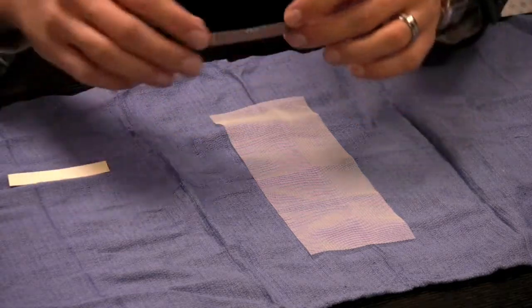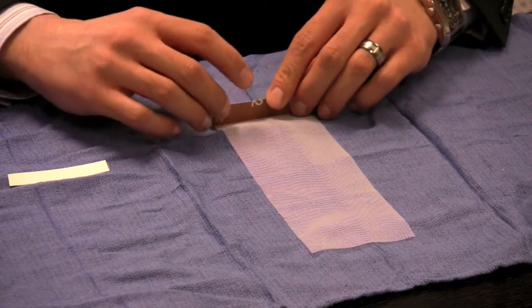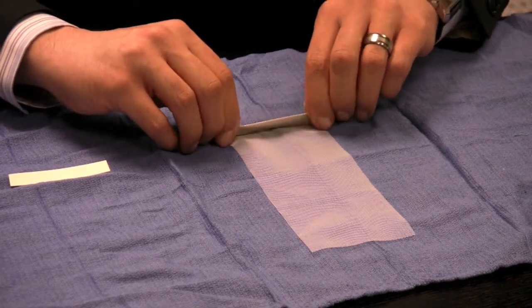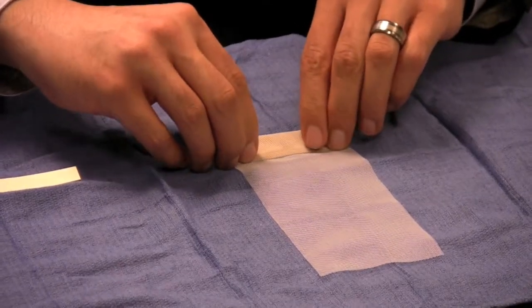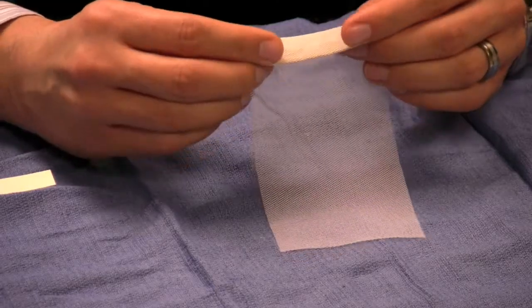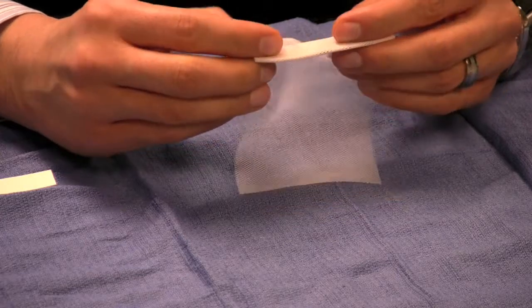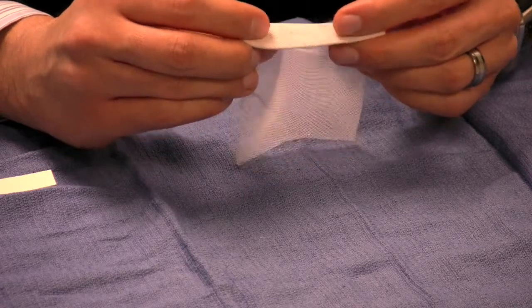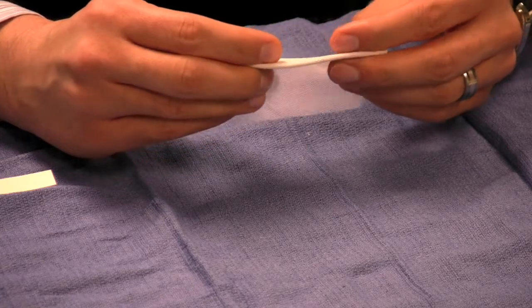Essentially it's got a rectangular shape, and what I do is I take the Mersilene and I start rolling it up, and I start wrapping it around this, little by little, giving it width. And it just depends on how much width I need. Now, as I'm doing this, this is not a precise chin implant. This is just giving me a template. The precision comes actually during surgery while the patient's asleep. What I do is I take the same chin implant and I can cut it and shape it into the exact shape that I need.